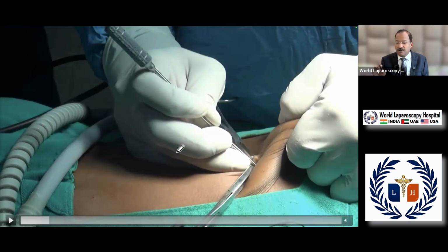So make sure, touch wood, never ever in your life will you perforate the aorta or perforate the bowel if you point towards the anus. Because if you point towards the anus, there is a hollow sacral curve and you have more room in the pelvis, and you are lifting the abdominal wall, so it will not go to the bowel. And it cannot enter the aorta, vena cava or common iliac vessel, because they are not there. The common iliac vessel is not in the pelvis, it is on the side wall of the pelvis.